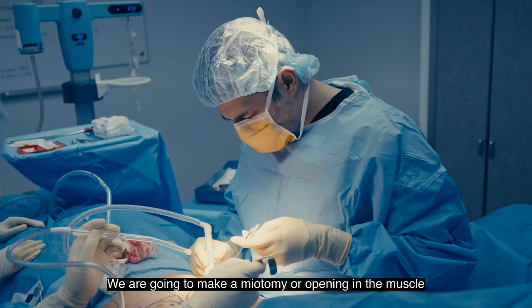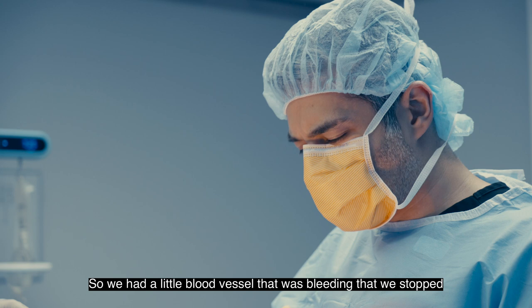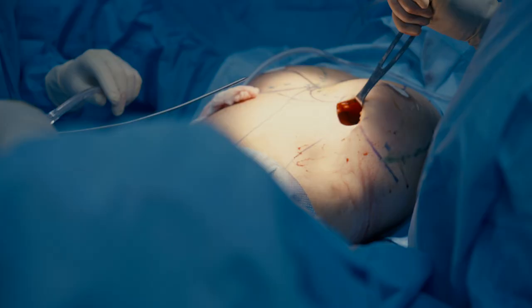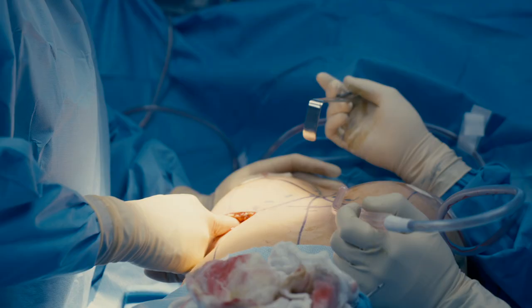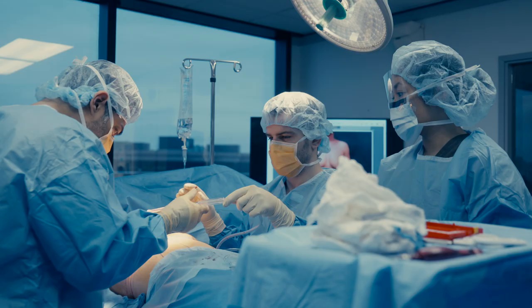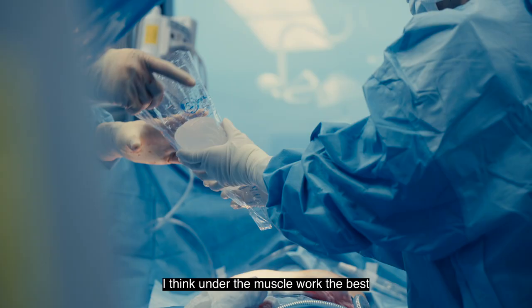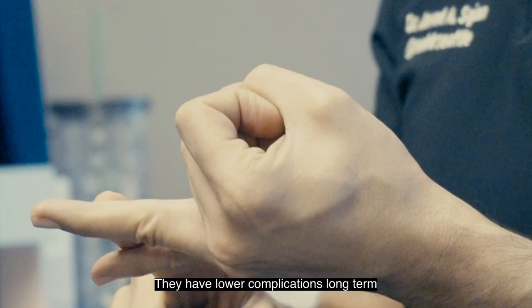We're going to make a myotomy, or opening in the muscle. We had a little blood vessel that was bleeding that we stopped — this is very normal in this surgery. We're going to release medially with the dissector and make cleavage. This is the pocket; the pectoralis major muscle is above us. The approach today is through the fold, under the muscle. I think under-the-muscle implants work best because they have the most support, lower long-term complications, and give her a better shape.